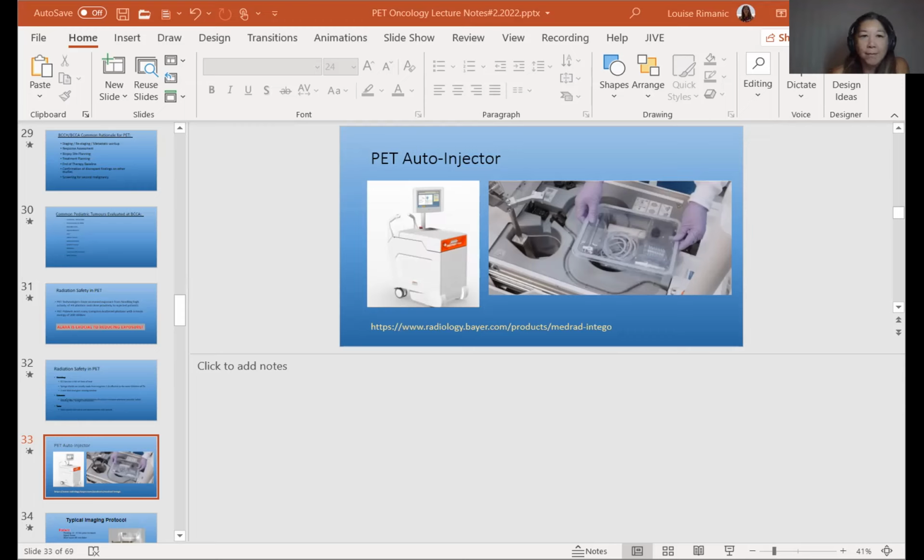accuracy and sensitivity, specificity. So according to the current AUCs, gallium-68 PSMA is used mainly for imaging primary and recurrent prostate cancer. There are some future applications which may include staging before and after radiotherapy in patients with metastatic CRPC. So CRPC is castration-resistant prostate cancer.